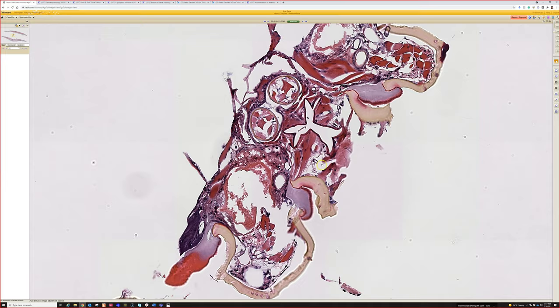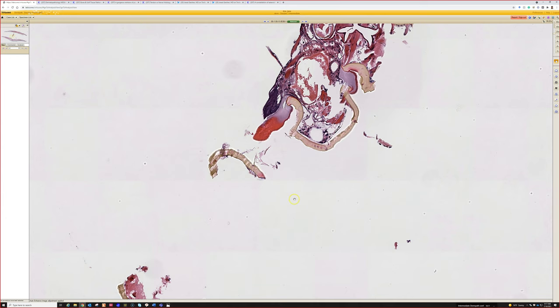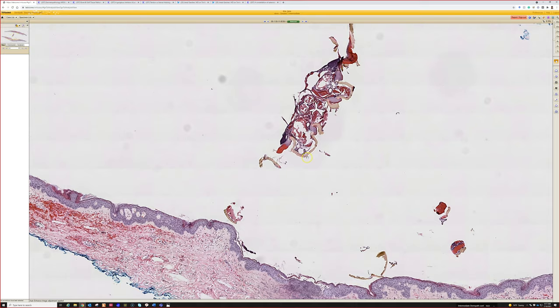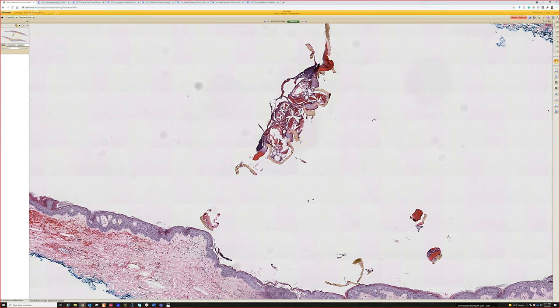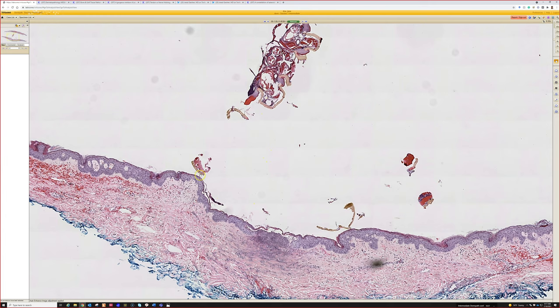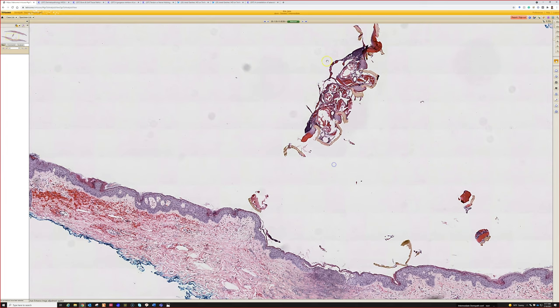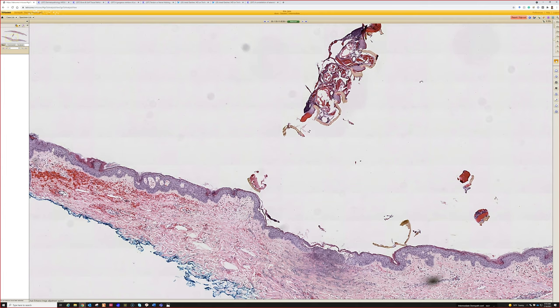How do we know it's a tick? Mainly the size and the position — it's an arthropod that was hooked onto the skin surface so much that it came off with the shave. It's way too big to be a scabies mite. Tunga penetrans — tungiasis — is a flea that burrows into the foot, but it's not going to be hanging off the surface; it'll be embedded within the epidermis and covered by stratum corneum, and it's going to be five or ten times bigger and on acral skin. The only other real mimic would be bot fly, which would be down in the dermis. And sometimes I've seen arthropods that accidentally got into the surface of a purulent tumor or got trapped in the block during processing. But yeah, this is a tick.